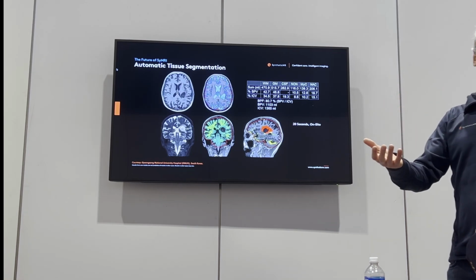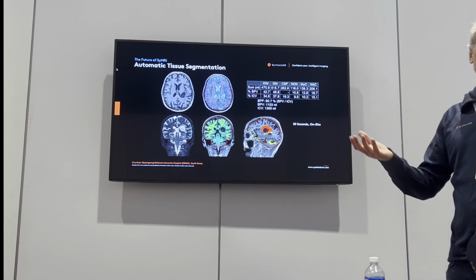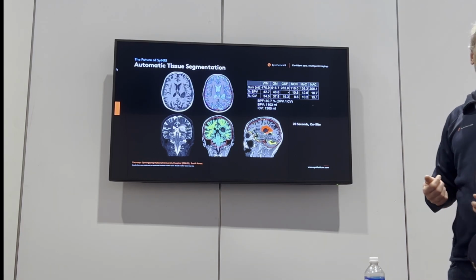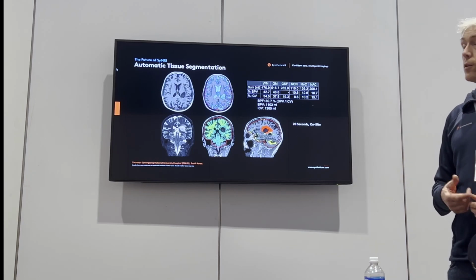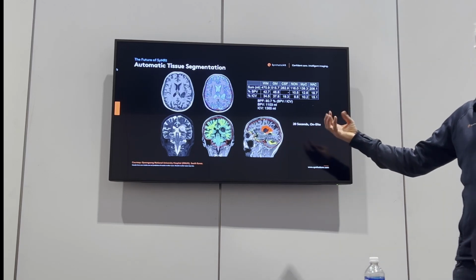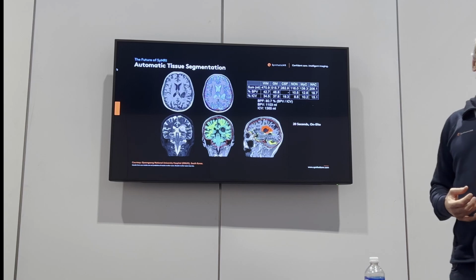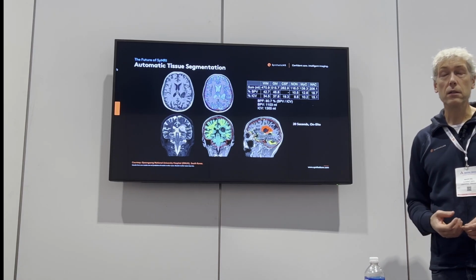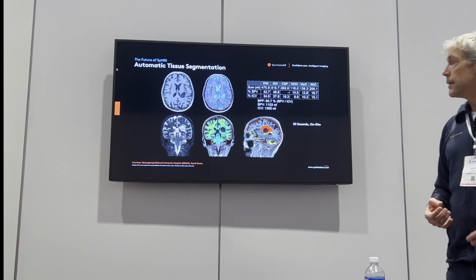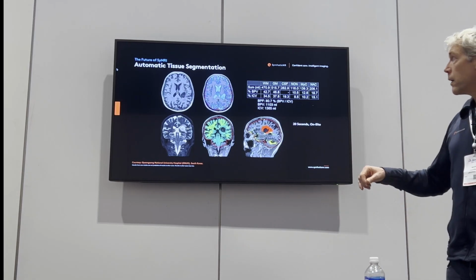So anything that falls outside that will end up in this non-thing. That could be blood, like all the vessels in there. It could be some artifacts, but it also contains pathologies. So it's non-specific. You shouldn't really use it, but at least it's kind of a messenger that something is going on there. It's beyond what is considered to be normal. All right, I'll get back to that.